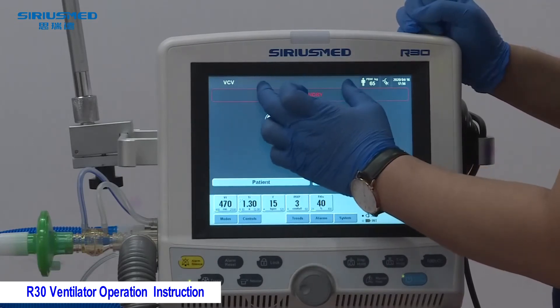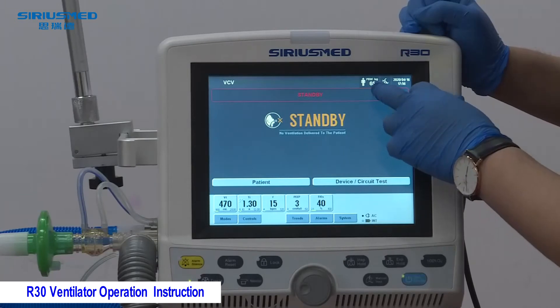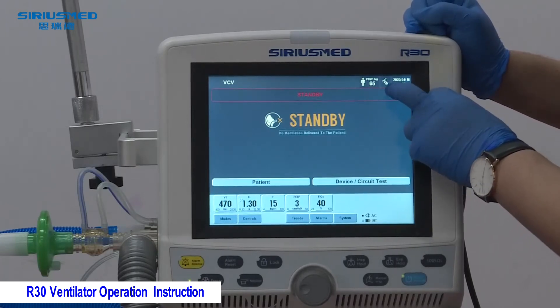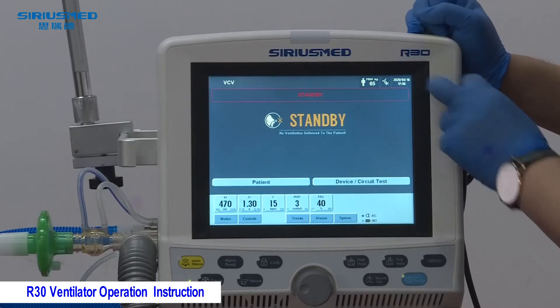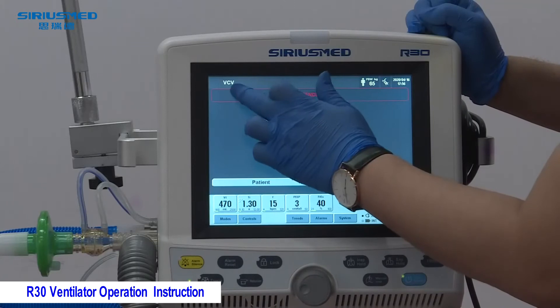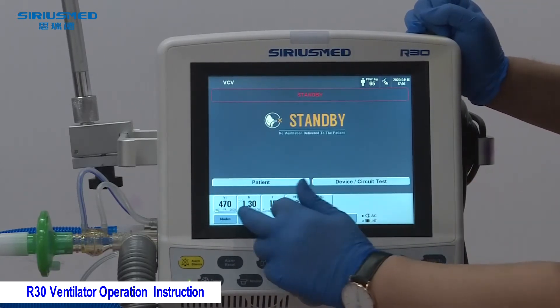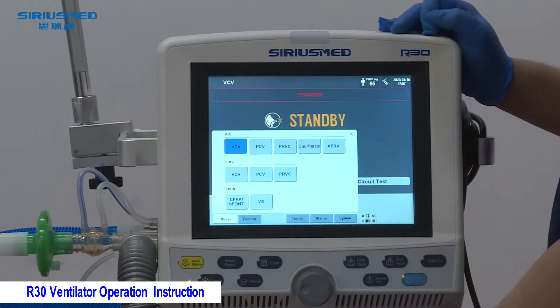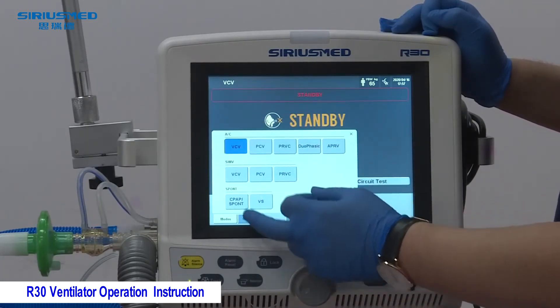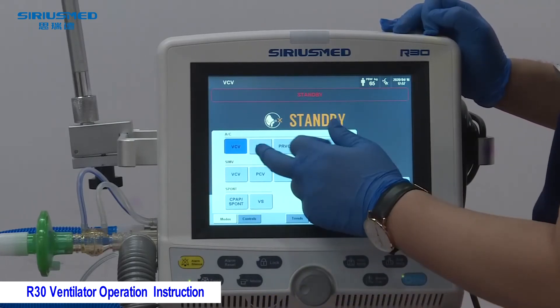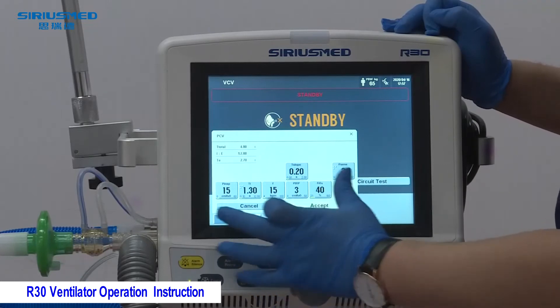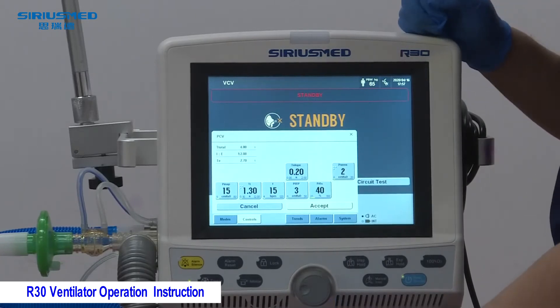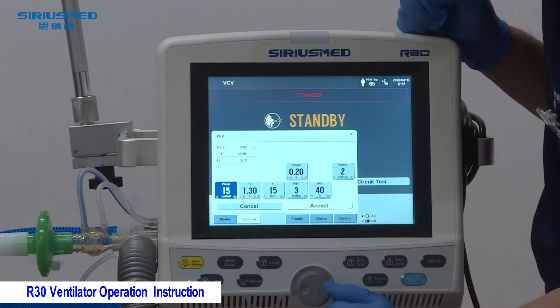Now we can see the ventilator interface. This part shows the selected ventilation mode, this part is the alarm section, and this part shows patient information including type (adult), PBW, ventilation type (invasive), and date and time. To change the ventilation mode, go to the modes menu — the R30 supports almost all modes including VCV, PCV, SIMV, and VS. For example, selecting PCV will prompt you to adjust the setting parameters.